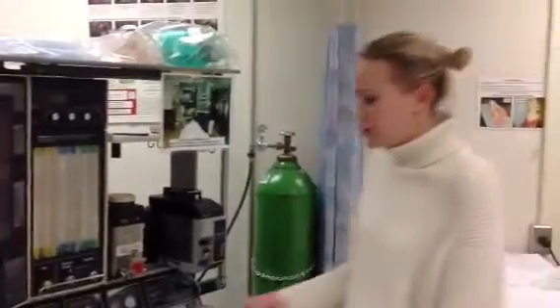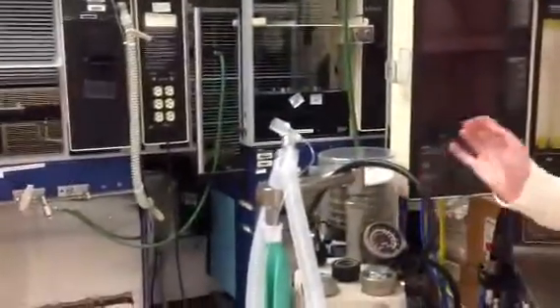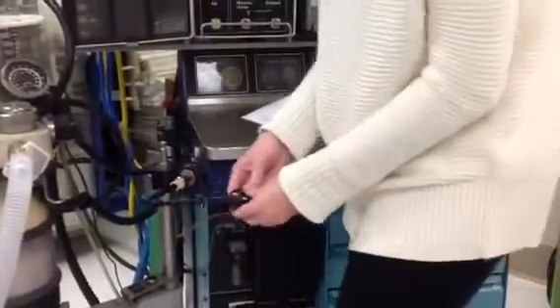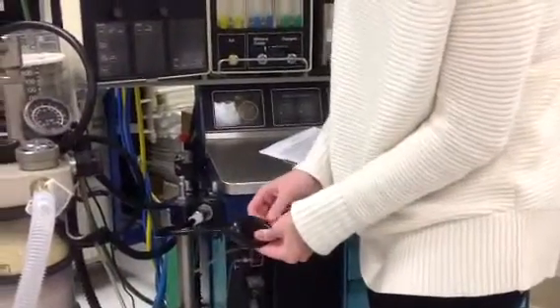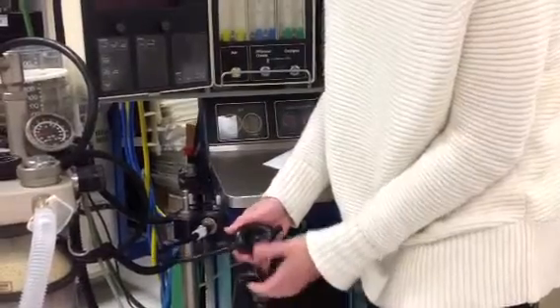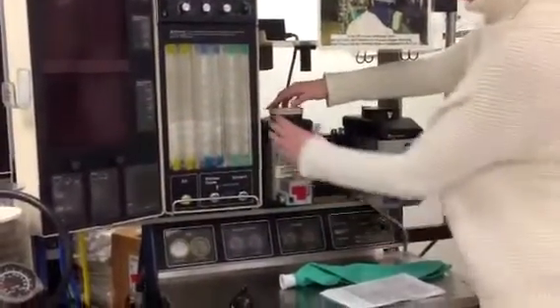Okay, so you come to the common gas outlet over here, disconnect and attach your suction bulb to perform the low pressure check. You take out all the air of the bulb and make sure it stays depressed for 10 seconds, which means there's no leak. Then you come up to each of your vaporizers and perform the same check.